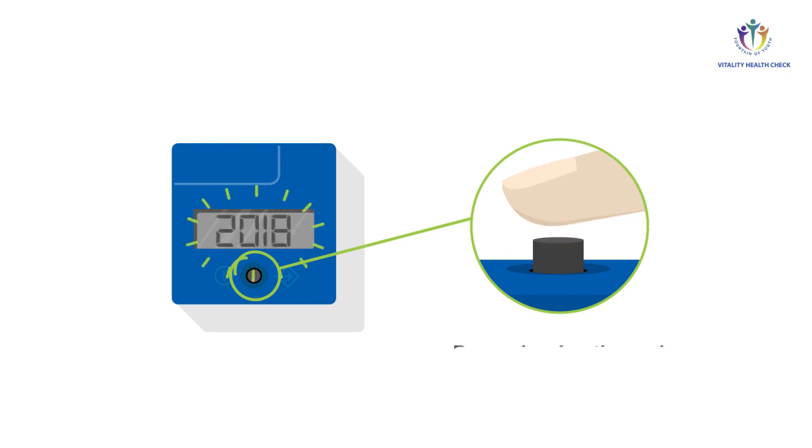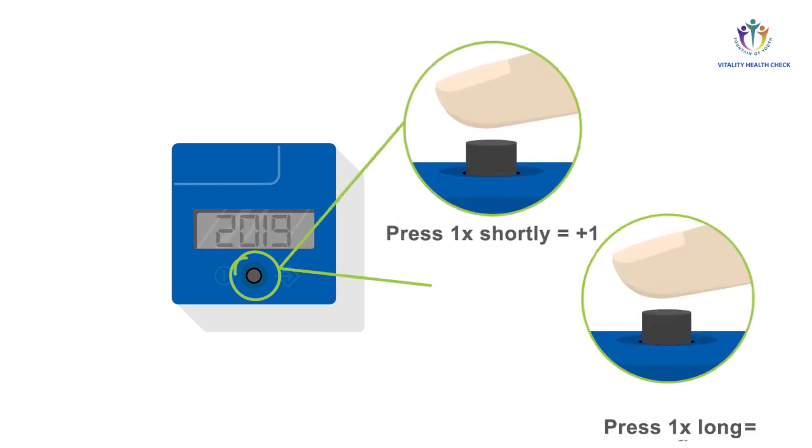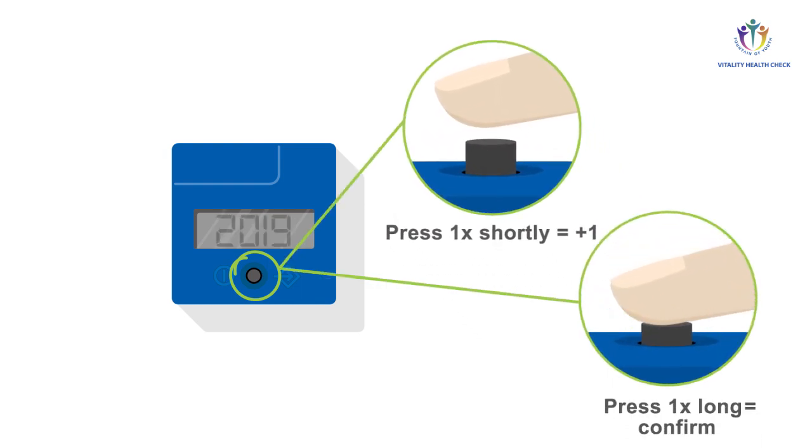At first, you have to set the year. Press the button shortly to increase the number of the year by one. To confirm the new setting of the year, press the button long.